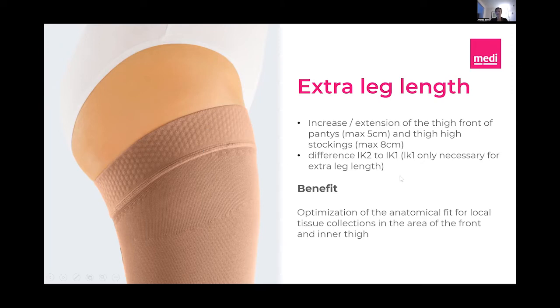Okay. That's extra leg length. Definitely something to remember. This is how it basically looks. Regular length of thigh-high stocking versus a stocking with extra leg length. And you can see here also there's a little knitting mark, which shows you the elliptical piece that has been added to the stocking.